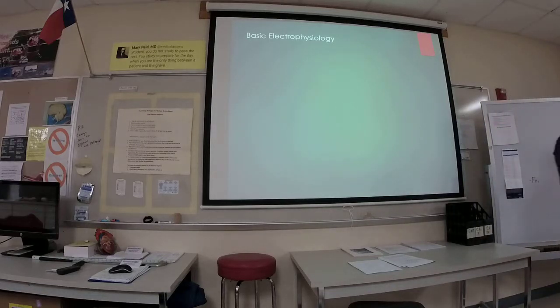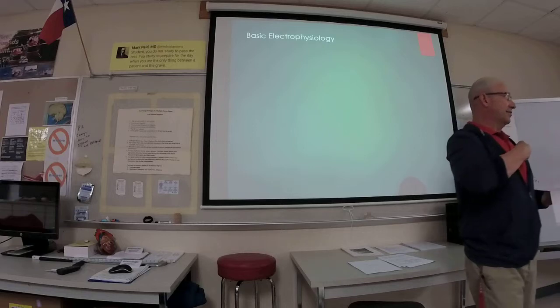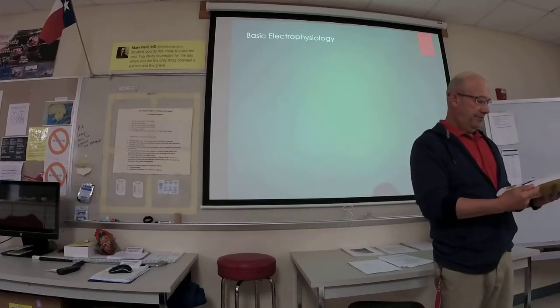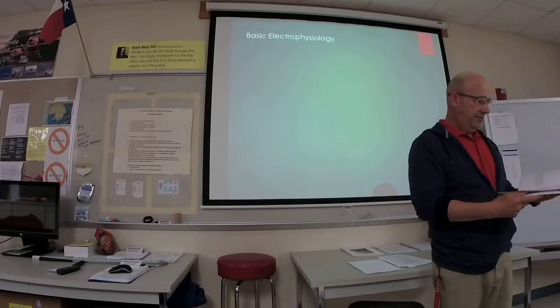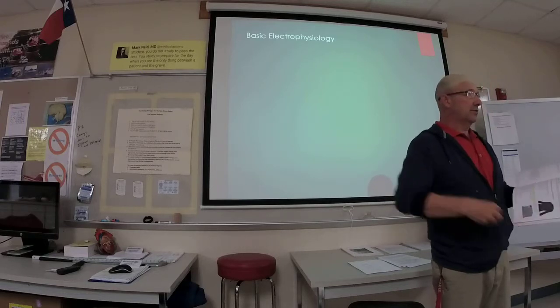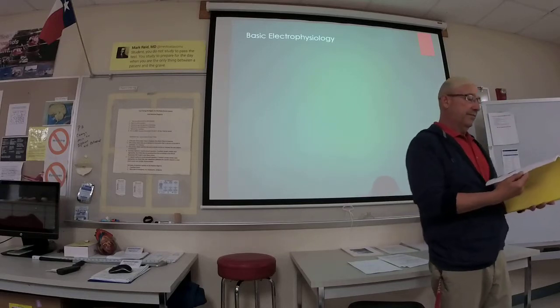And then 3-, 4-, 5-lead placement. The 5-lead we may not be familiar with, but it's just that center lead. Remember, the leads never go on a bone. The lead placement always goes in the intercostal space.